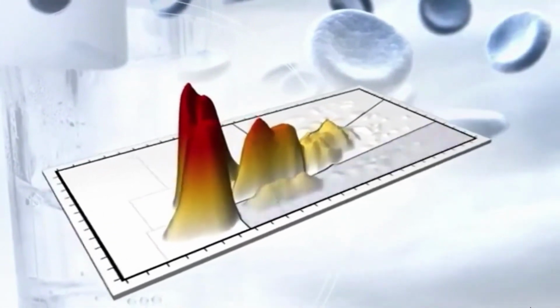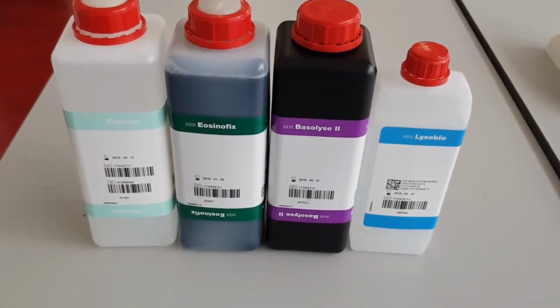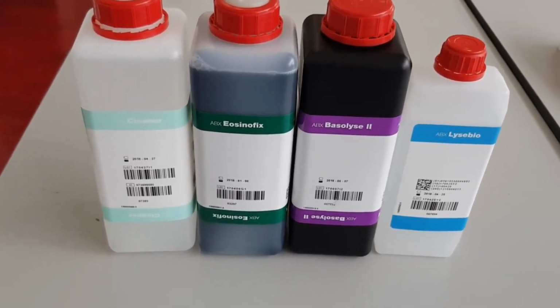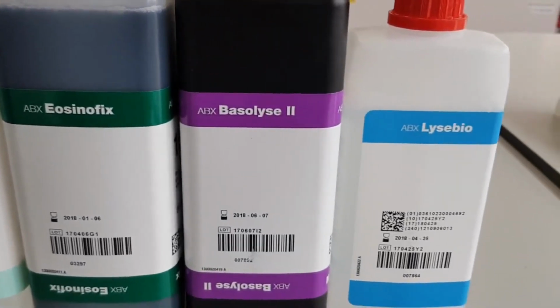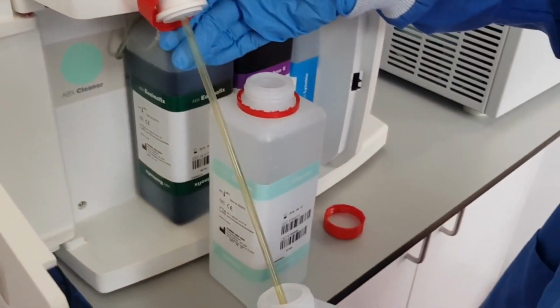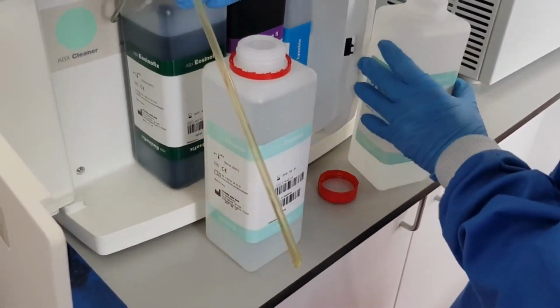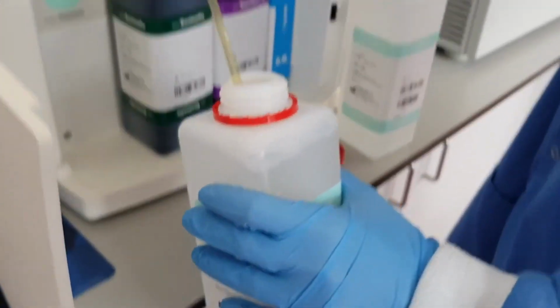The reagents used in hematology analyzers are cleaners, which are used to clean bath or chambers in the measuring unit. Diluent, which is normal saline used for the dilution of blood samples to the proper concentration for the cell counts. Hemolysis reagents, used in vitro for quantitative detection of white blood cells, number in the whole blood and hemoglobin concentration, etc.